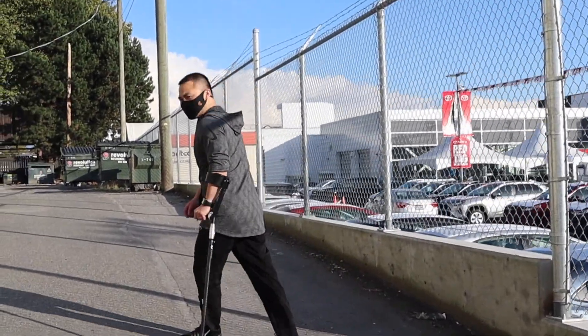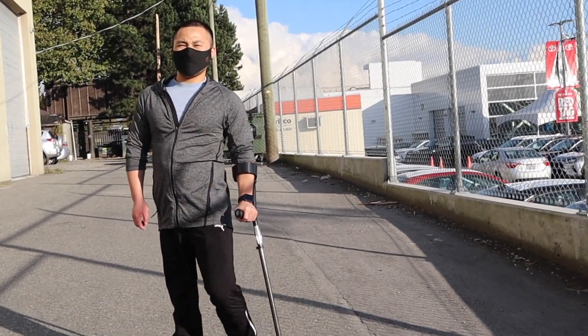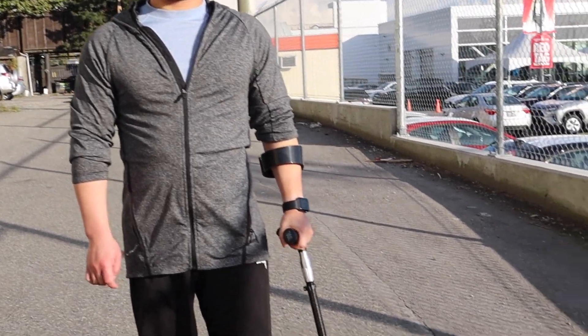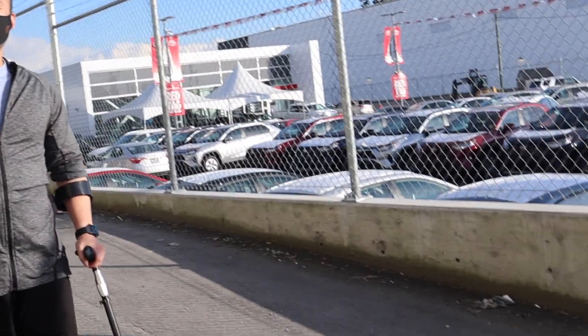Going up that steep, I'm impressed that you even have a step length on your right. It takes so much power to get that forward. When it starts getting that step, it's not surprising to kind of go to like a step two, but that's great.